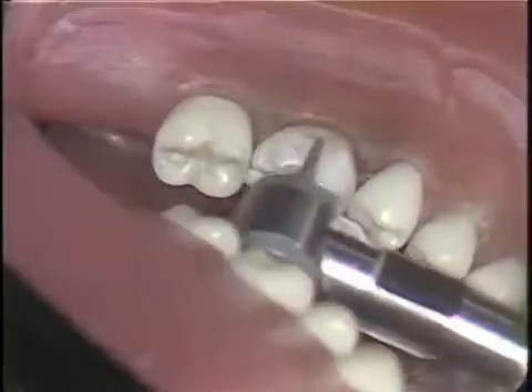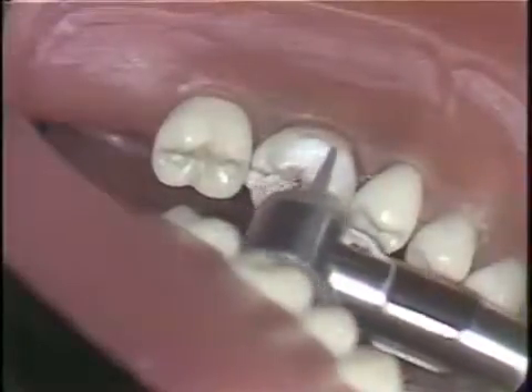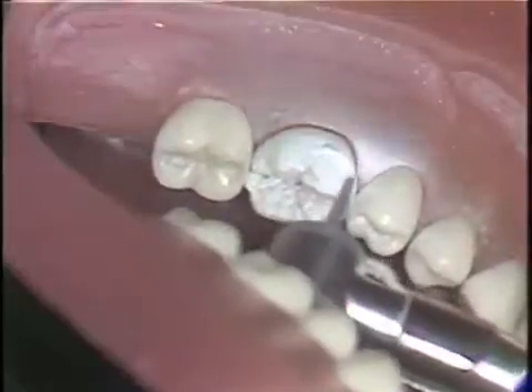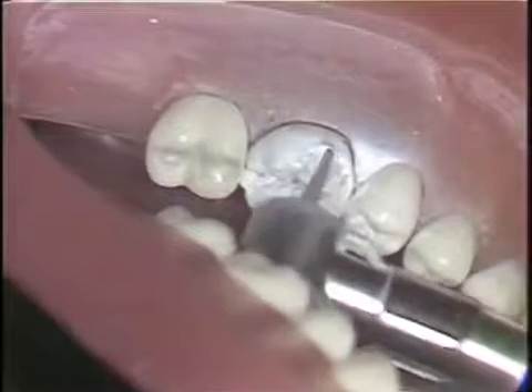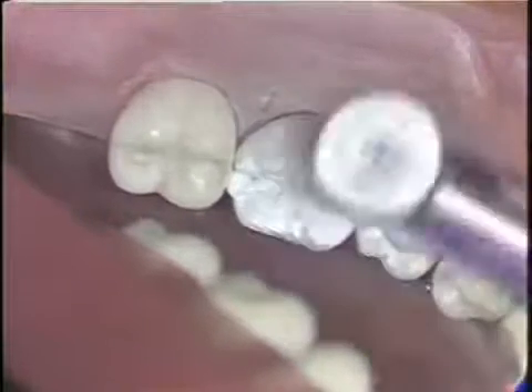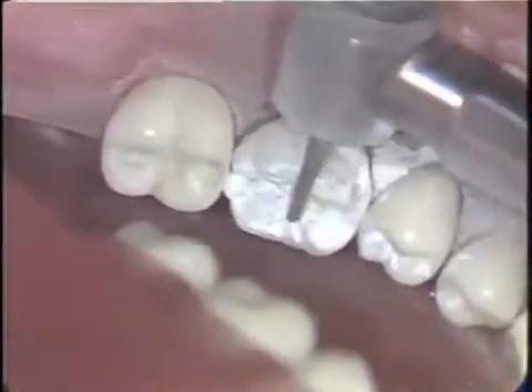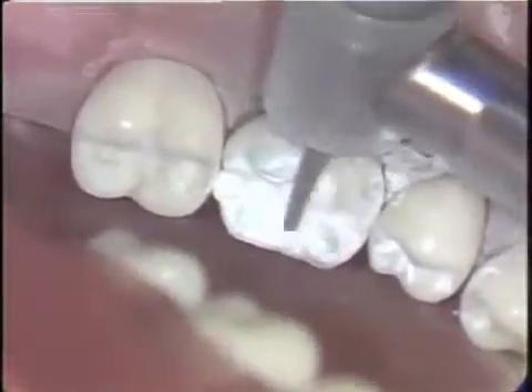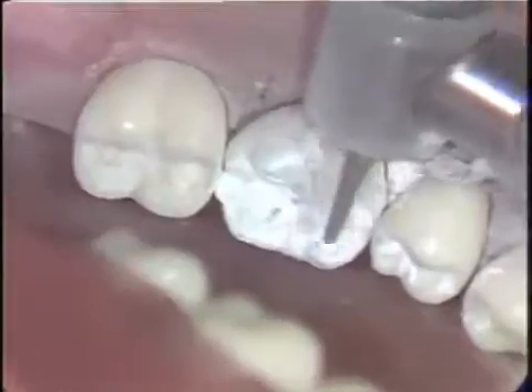Remove all of the caries areas and previous restorations and cement bases from the tooth using the appropriate cutting instruments and excavating instruments. Remove any weakened enamel and undermined cusps. For the purpose of this exercise, one half or less than one half of the coronal portion of the tooth should remain. Avoid exposing the pulp chamber of the tooth.